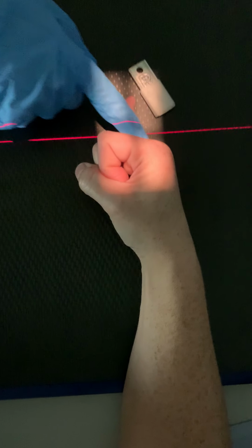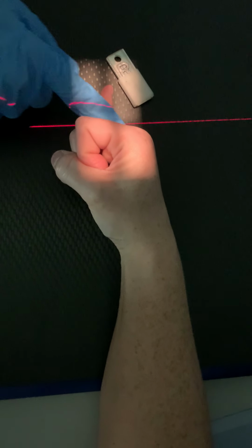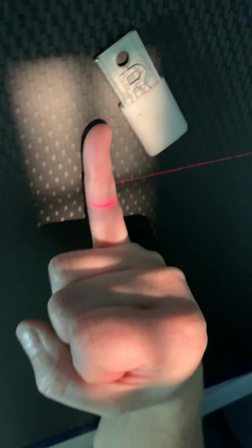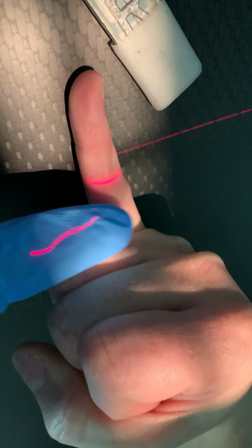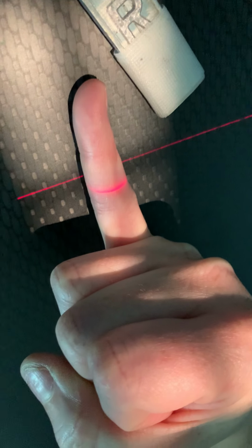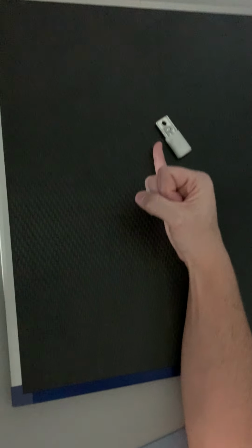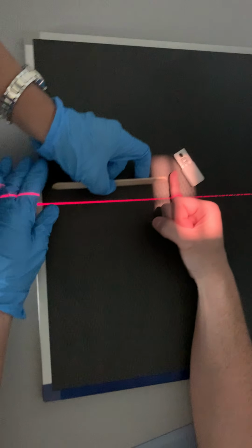Now, notice at the metacarpophalangeal joint, I've got the overlap of these other fingers. Can y'all see that right there? Right here, we've got the overlap of these fingers. So what we can do to help with that is we can take this tongue depressor, and Crystal, I'm gonna get you to give me your other hand. Let the patient help us, okay?